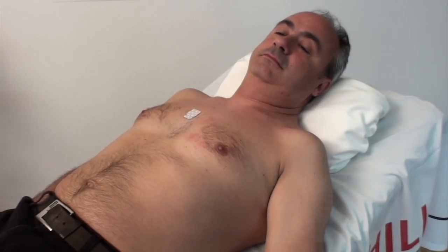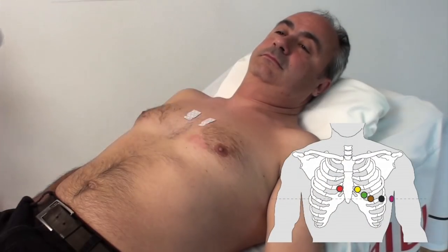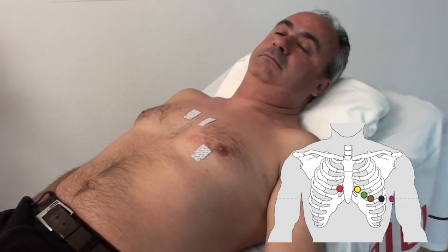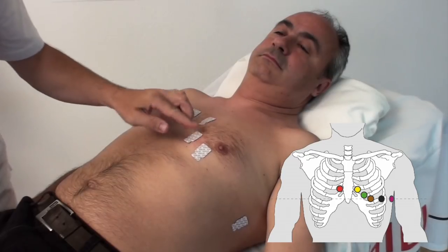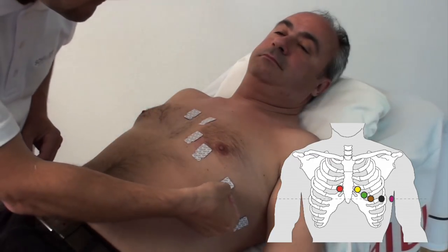C1 Red, 4th intercostal space at the right sternal border. C2 Yellow, 4th intercostal space at the left sternal border. C4 Brown, in the 5th intercostal space in the mid-clavicular line. C6 Purple, mid-axillary line at the same height as C4 and C5. C3 Green, between positions C2 and C4. C5 Black, on the anterior axillary line at the same height as C4.